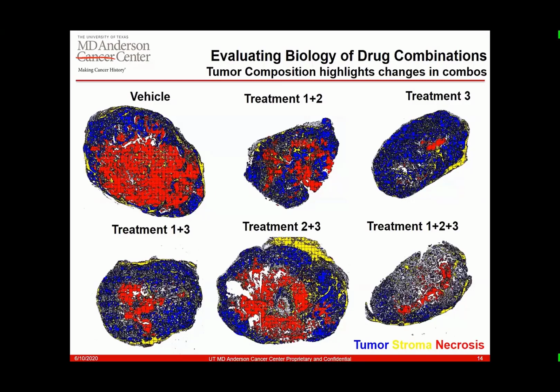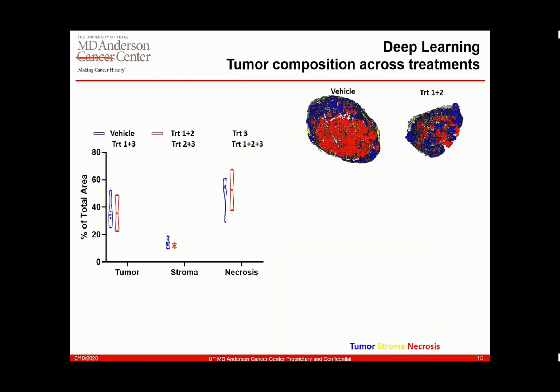And this is just scratching the surface, because since we used scans at 40X off of a Polaris on all of these, if we were really careful with the training sets, you could do a cell-by-cell resolution if you were looking for something very, very specific, or you had a tissue type that had a very recognizable cell type in there.